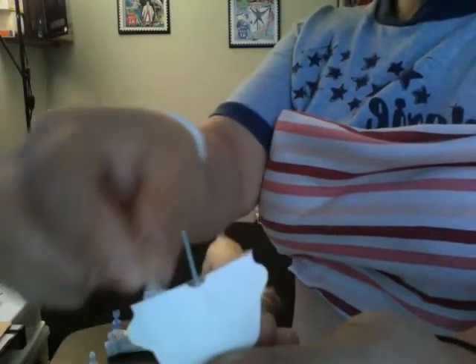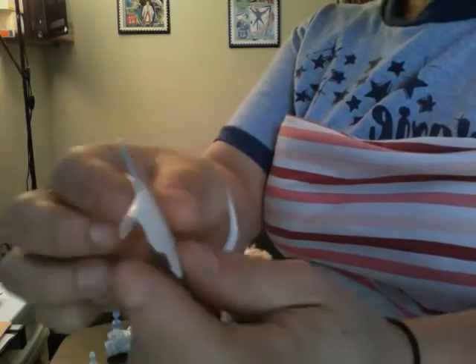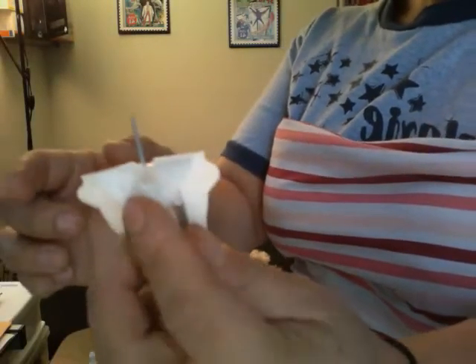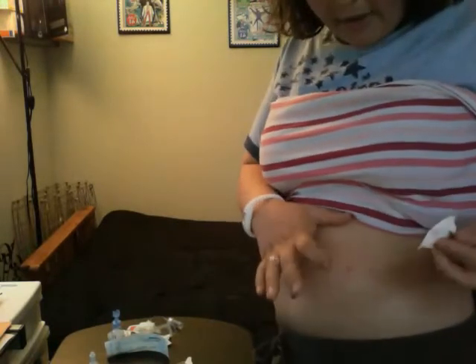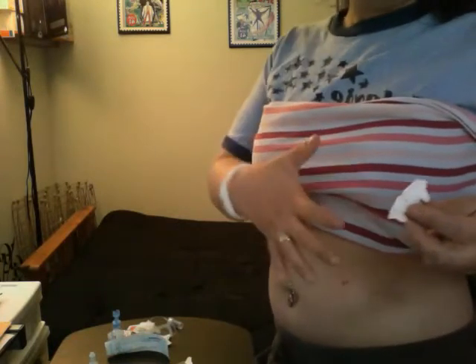Okay, now I feel it's a little bit sticky, but not that sticky. So I'm going to take this, I pull back the top, hold it here, and now I take off this, and that's my needle. It's really not that big. You really don't even feel it. I'm going to try to stay away from that area that's red, but you want to try to move in a circle so you give all your other areas time to heal and not get scar tissue.